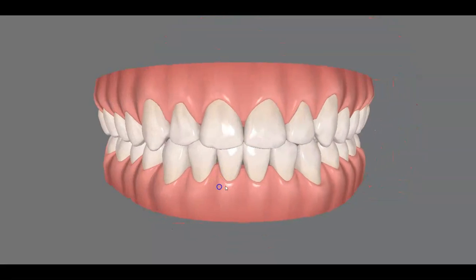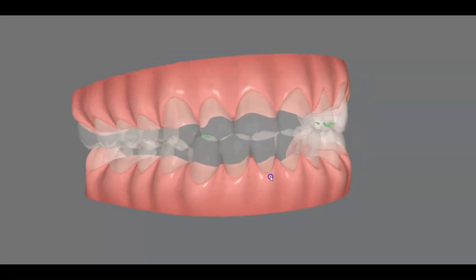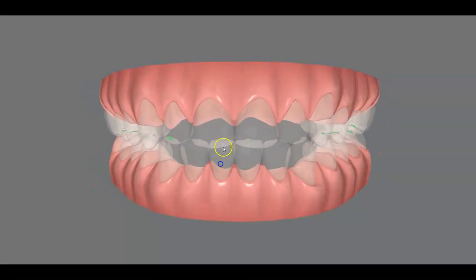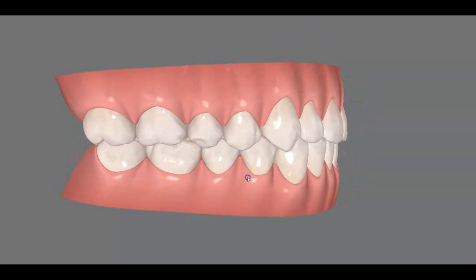We also see that the top teeth cover only very little of the bottom teeth, about 20, maybe 30%. And you could see in this holographic view that the upper teeth are covering very little. We also notice the sharp teeth, and we'll just look on one side for now, this sharp tooth compared to this sharp tooth, their relationship, and this tooth to this tooth.